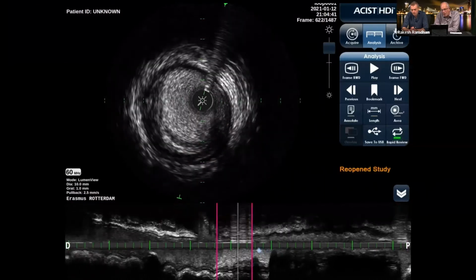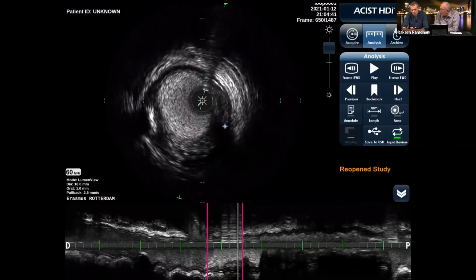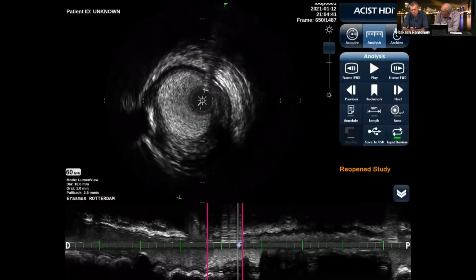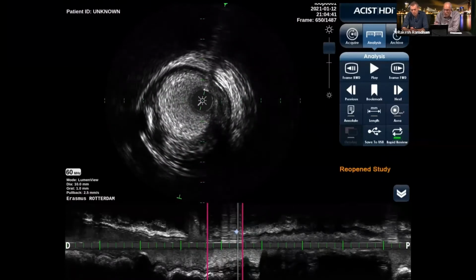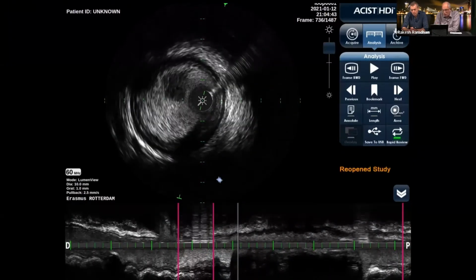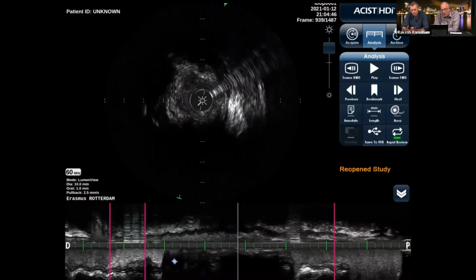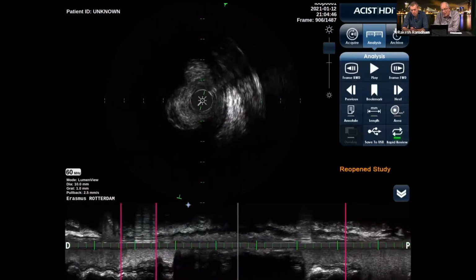And you see around here, you see the black part in the same shape of the vessel attached to the wall with a double layer in there. And that's the organized thrombus, because organizing always starts from the outside of the vessel where it's attached to the wall. So probably we find some organized thrombus also in here against the wall.